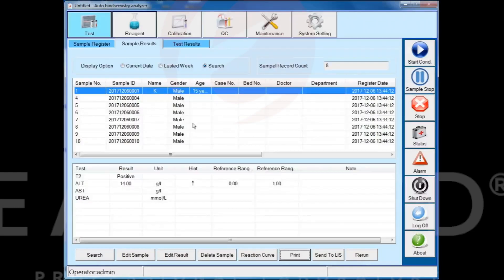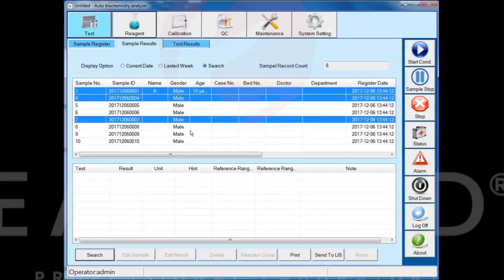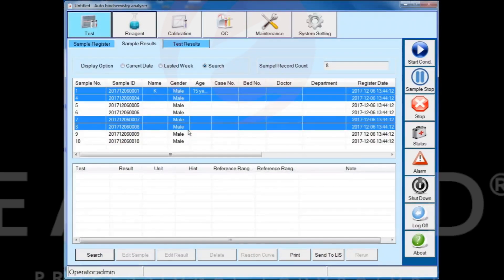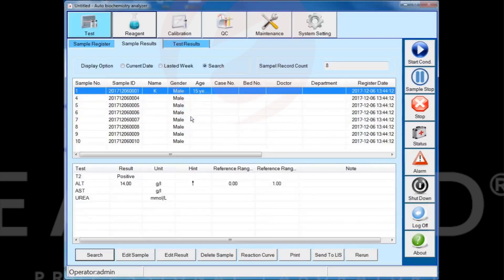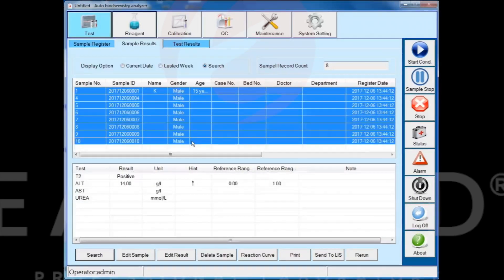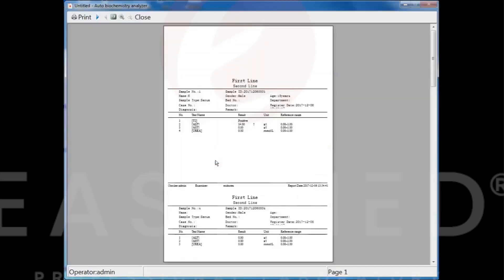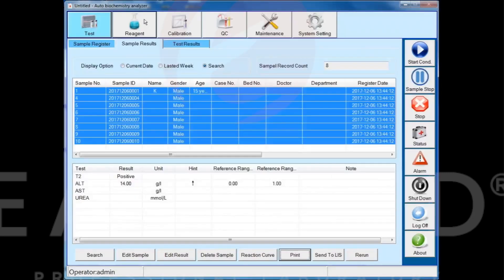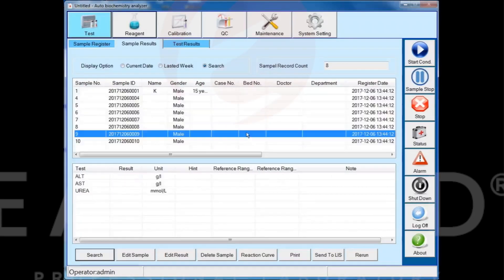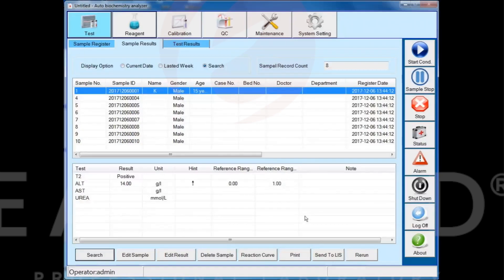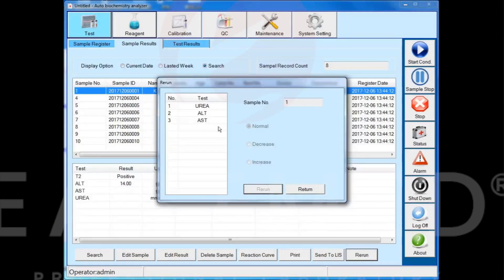You can select discontinuous sample information by combining the CTRL key and left mouse click. You can also select continuous sample information by combining the SHIFT key and left mouse click. Select a sample information and click the rerun button to review the test items of that sample.